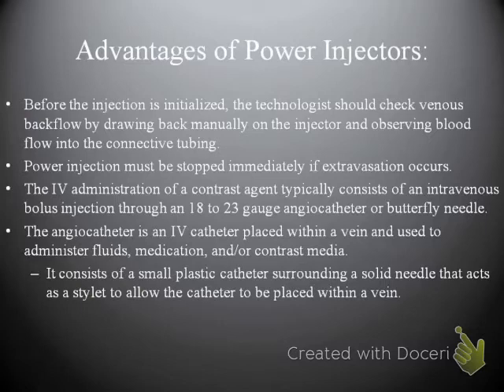What I typically do before I hook the injector up is I take a 10 milliliter syringe of saline and I attempt to draw back on it first, and if that doesn't work, I push the saline through and see if I can feel it going through just by palpating the area around. And if I'm not seeing anything that looks like an infiltration, then typically we'll go ahead with the injection. But if there's any discrepancy there, then it's always best to double check things.